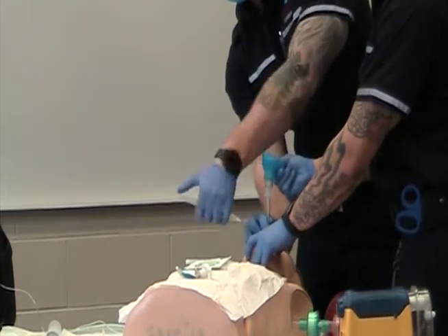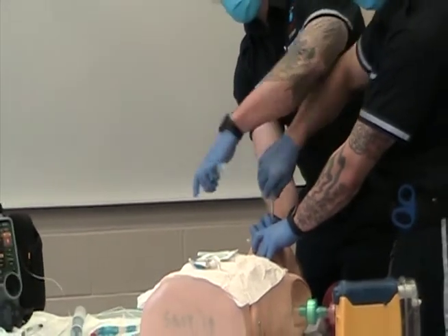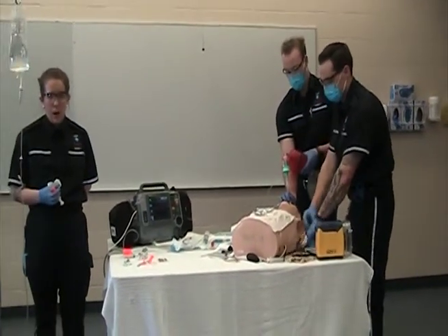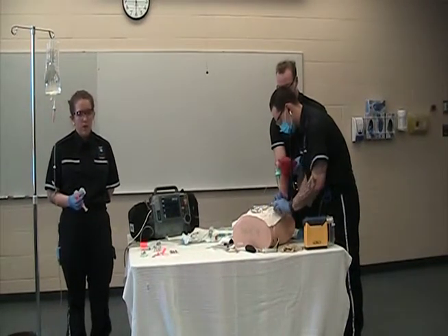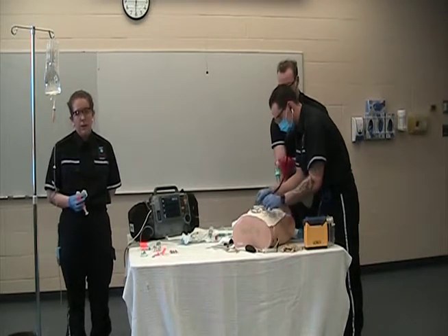Perfect. So just like with any other intubation, we are going to do our 6 confirmations. So the first being the EDD, checking for reinflation. The second is listening over the epigastrium, looking for absent sounds. Then auscultating over left apice, right apice, left base, and right base. We visualize the tube passing through the cords. We've seen misting through the tube. And we're also looking for a gold standard of ETCO2 waveform.